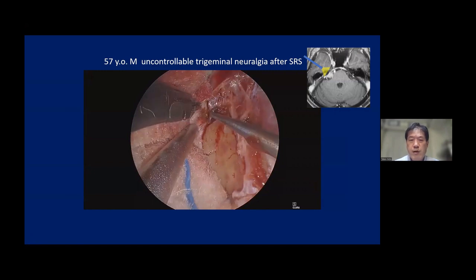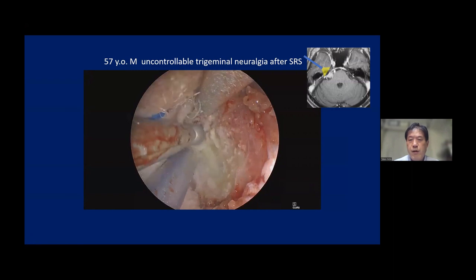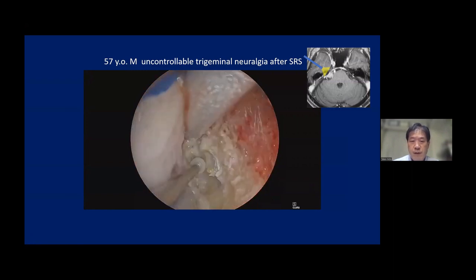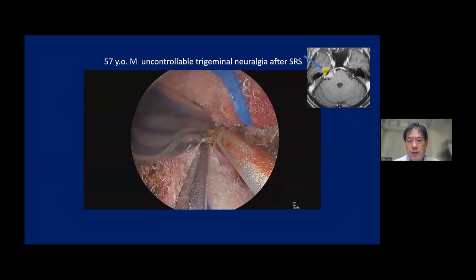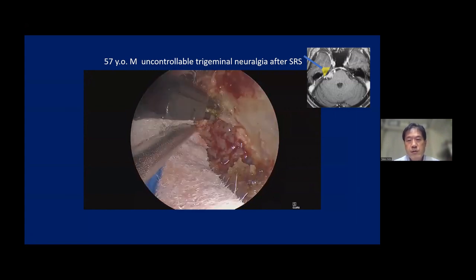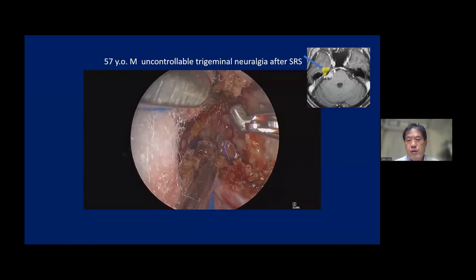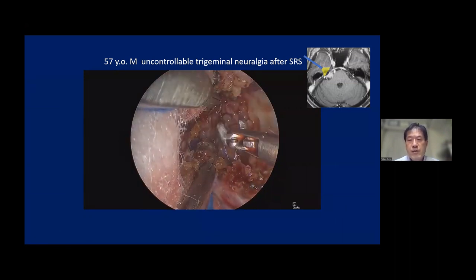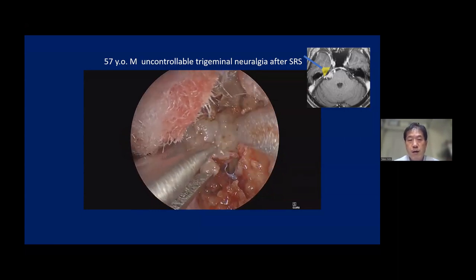This is the trigeminal impression. And then I drill out the petrous apex very carefully and then cut the SPS, most anterior side, just lateral to Meckel cave. Now, most part of the tumor was completely devascularized and detached. So we start the tumor removal.